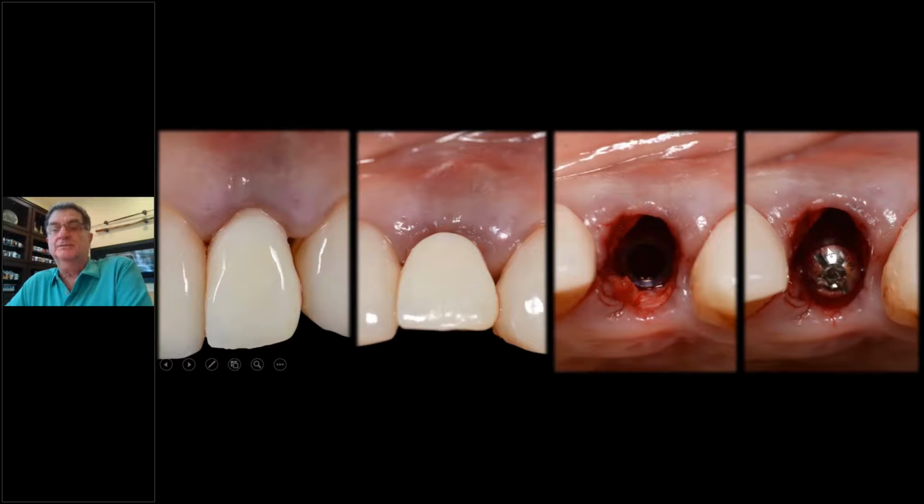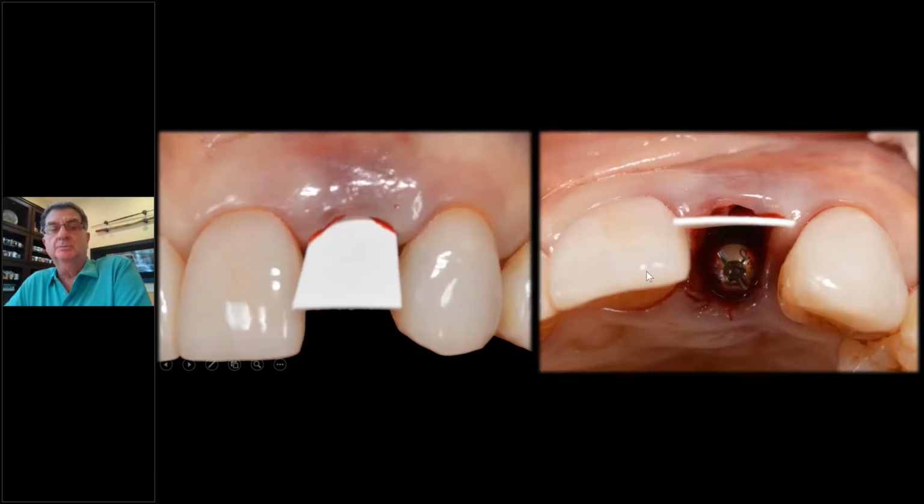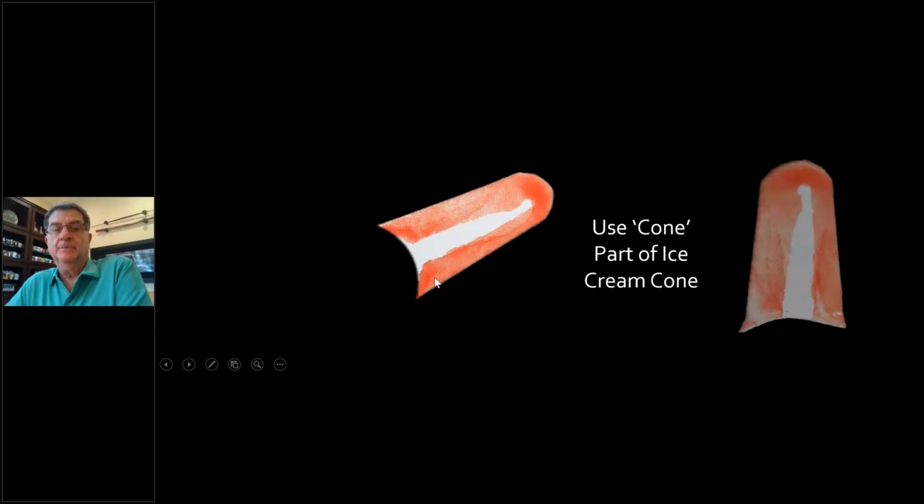And there's the graft. Now we put a straight cylinder on, and we're going to pack the buccal. And here's the membrane being trimmed. Here's one of the tricks with these stiffer membranes. I trimmed it and then put it in. And when I took it out, what did I see? I knew exactly where the height of the tissue was by the blood. So I'm going to trim this back right up to that point. Trim it back. And that's exactly the height of the tissue.